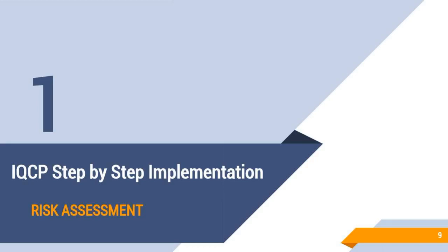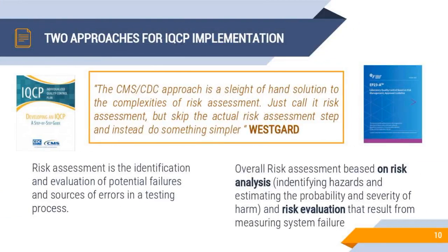So the implementation procedure, or steps. First of all, if I want to do IQCP, I have to do a risk assessment. For risk assessment, there are 2 articles, and I put their links in the last slide. I encourage everybody to read them. You have 2 articles as a reference. There are the CLSI guidelines EP23 and, on the left side, the CDC CMS development of IQCP step by step. These are an excellent reference for you. They make your life easy in implementing your IQCP.